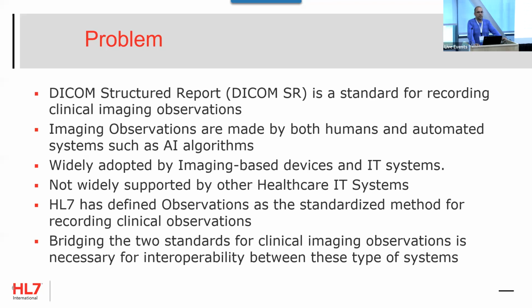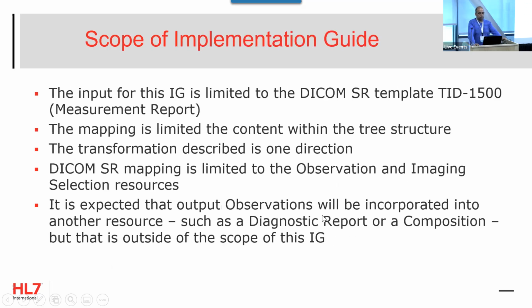Even though we will be using imaging study and patient, we have to refer to a device that is the representative of the AI algorithm. But you see that the main goal here is to bridge the two standards, DICOM and FHIR, to map this observation.